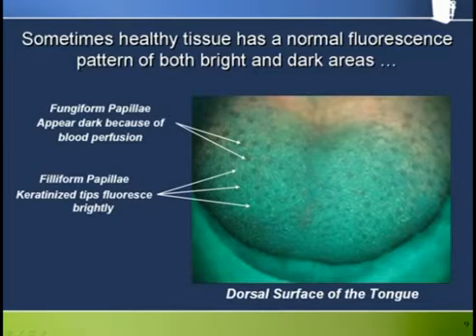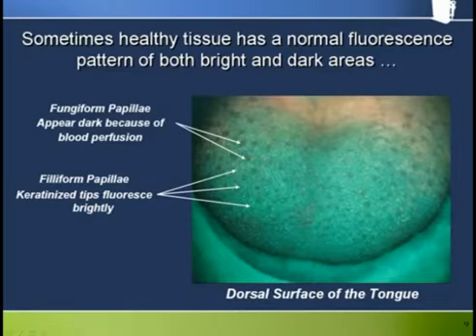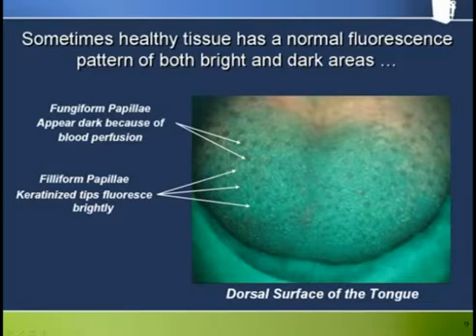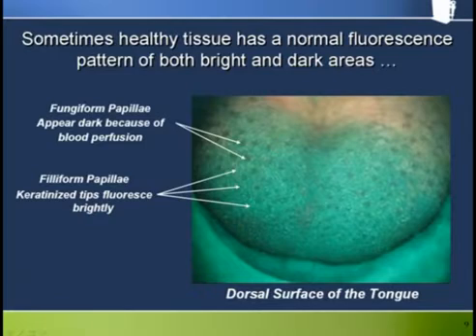The filiform papilla have keratinised tips which fluoresce quite brightly under Velscope. So here we are seeing examples of some of the underlying concepts explained in the science module. Blood is a strong absorber and causes the perceived fluorescence to decrease, and keratin fluoresces which causes the perceived fluorescence to increase.